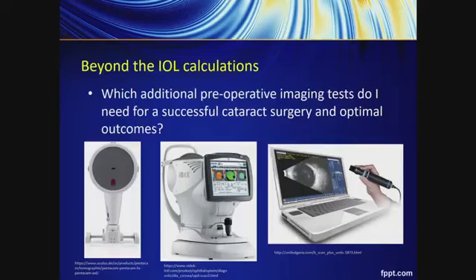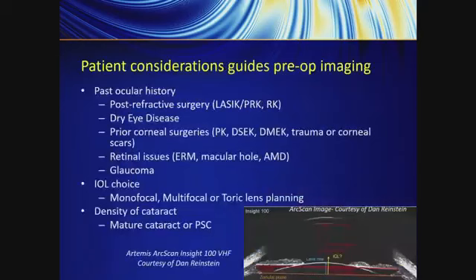So in terms of imaging the eye for cataract surgery, we want to make sure that we're doing all the imaging necessary to make sure we have the right power of the IOL. That is really the number one goal. But we also want to make sure that the eye is healthy. So let me focus a little bit on that.